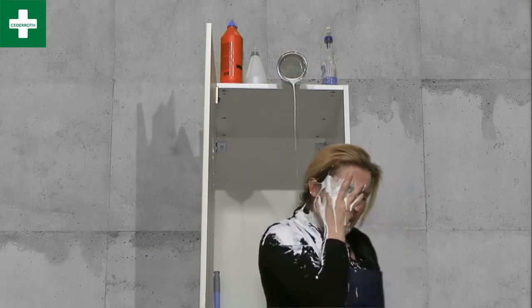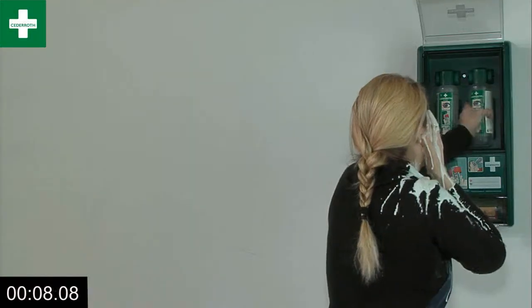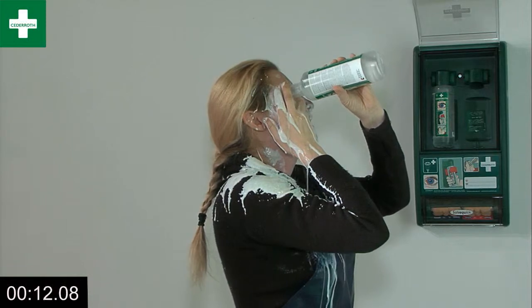No time to lose. If someone's got corrosive liquid in their eyes, every second counts. Get hold of the bottle, twist, and you've got an effective and guaranteed fresh eye wash.